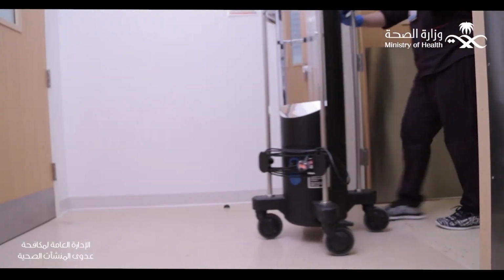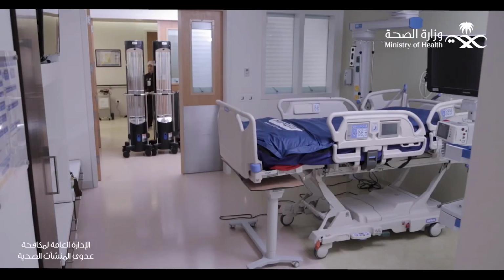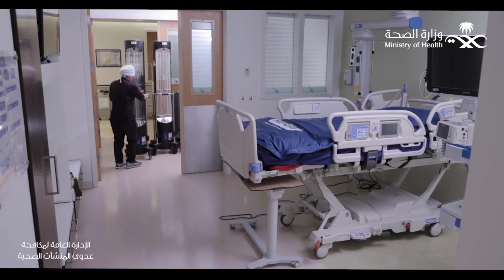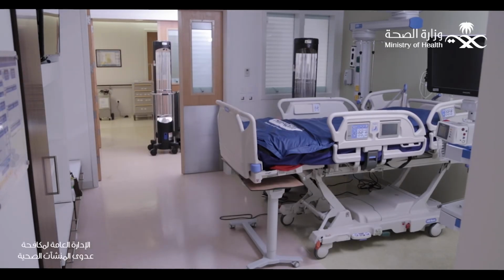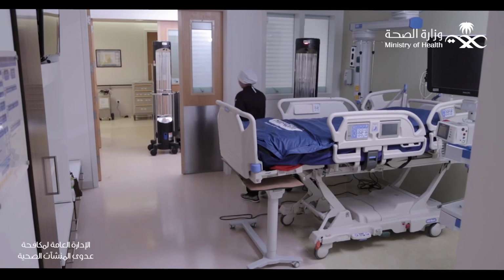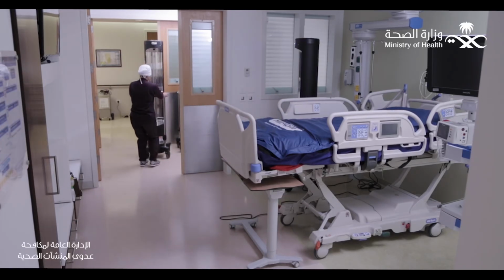Then comes the role of the final disinfection of the isolation room by using ultraviolet disinfection devices or a hydrogen peroxide disinfection device. The health worker is prepared to enter the room by disinfecting her hands and then pulling the ultraviolet disinfection device to the entrance to the isolation room, so that he wipes the wheels of the device before entering it to prevent the spread of any infection.